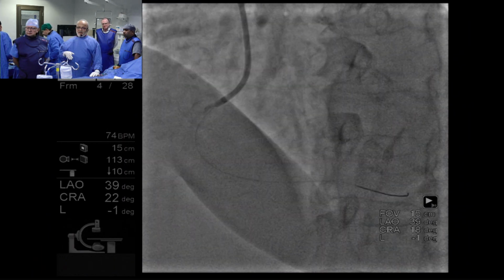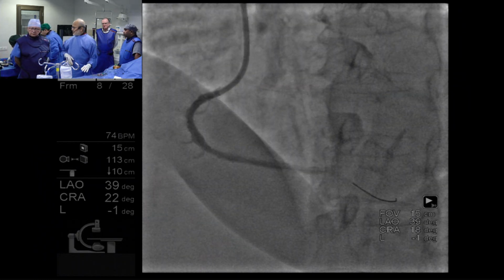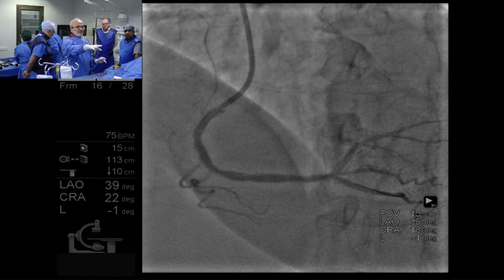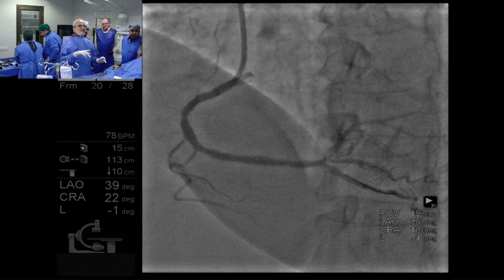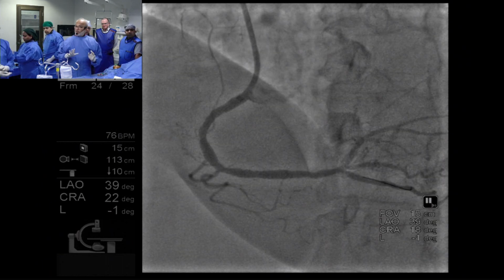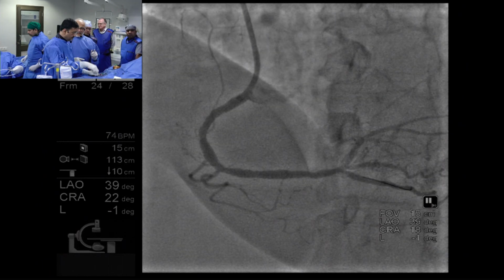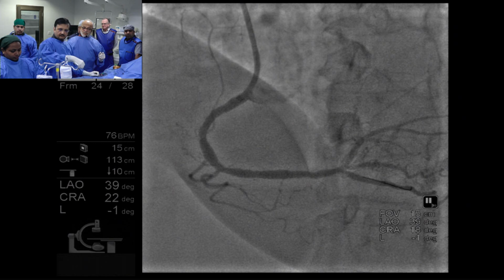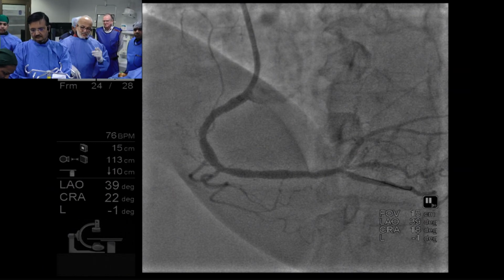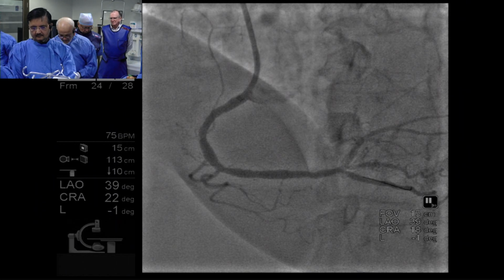So we are preparing IVUS. It will take 1 minute, and this is simply to know and learn about the distal lesion where we have, I think, cracked a calcific nodule, proper calcific nodule. So how the calcific nodule or calcium looks on IVUS and how we can interpret it, I think we would like to hear from Dr. Akasaka.